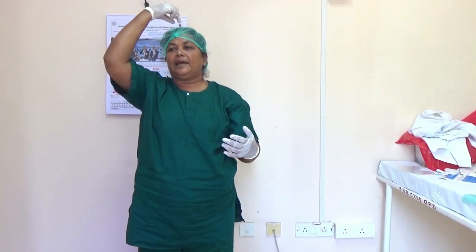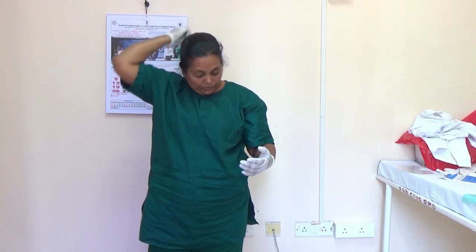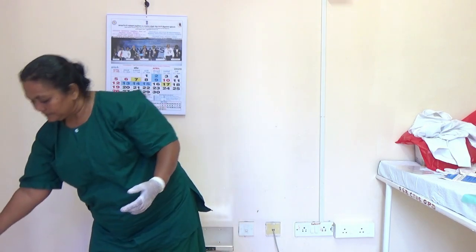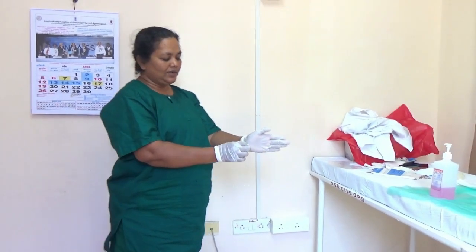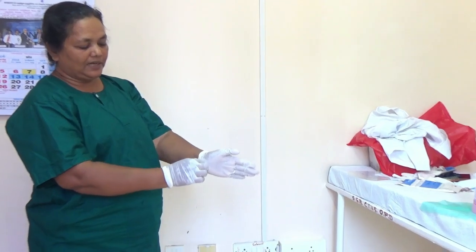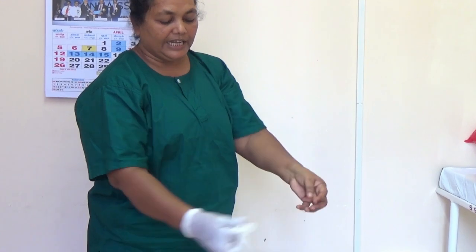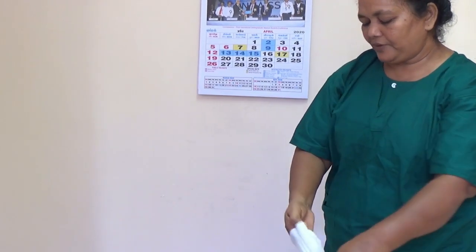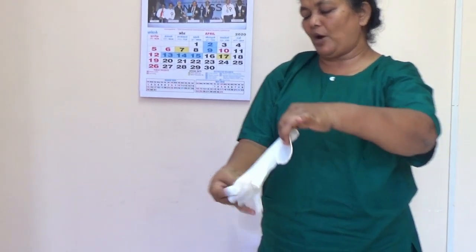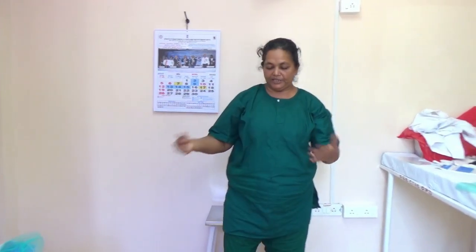Now the hair cap remains — this is clean, so you can just remove it. Now remove the inner glove: pinch the outside of the glove near the wrist and remove it slowly. Keep it in the other gloved hand, then put two fingers inside, slowly peel it off and remove it, making it into a pouch. Discard it in the red bag.